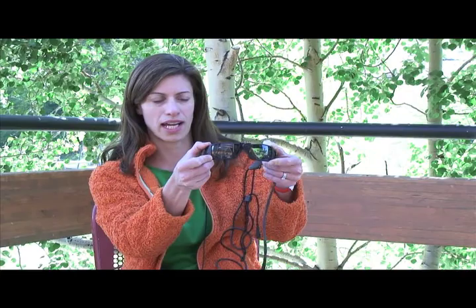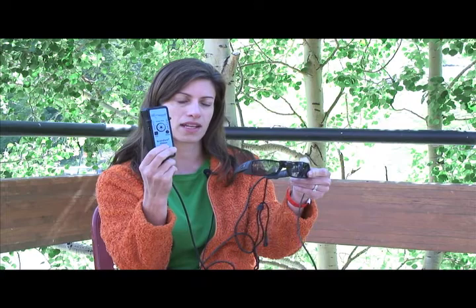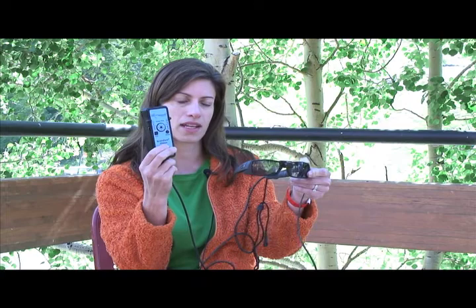I'll go through what the BrainPort looks like. This is a standard pair of Oakley glasses with a mini camera at the top — it has about a 73-degree field of view. That image from the camera is transmitted through a wire to a controller box, and that controller box converts it into a tactile image which is felt by the tongue.